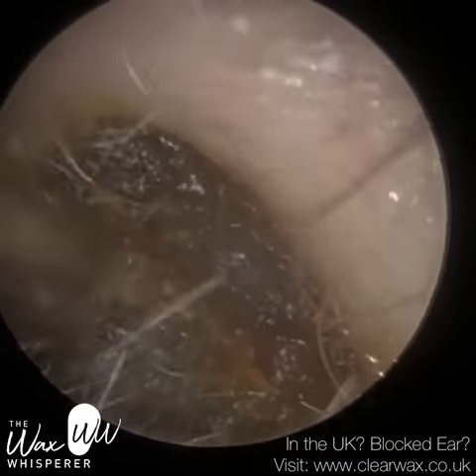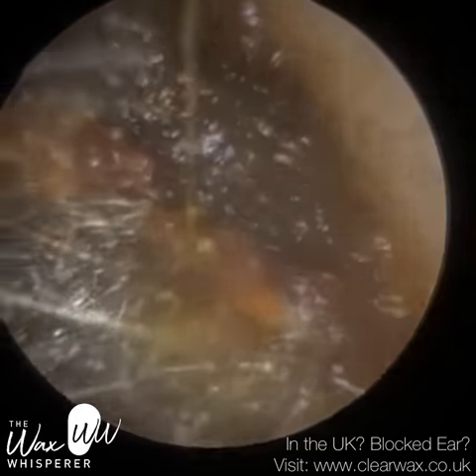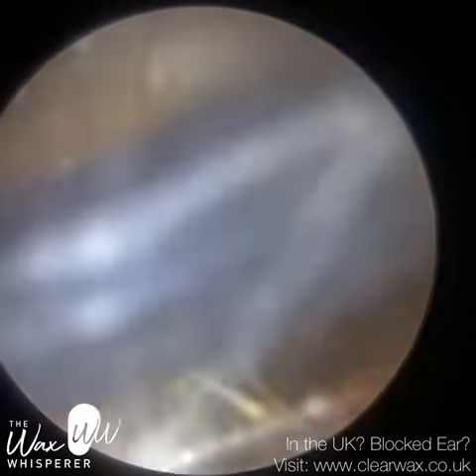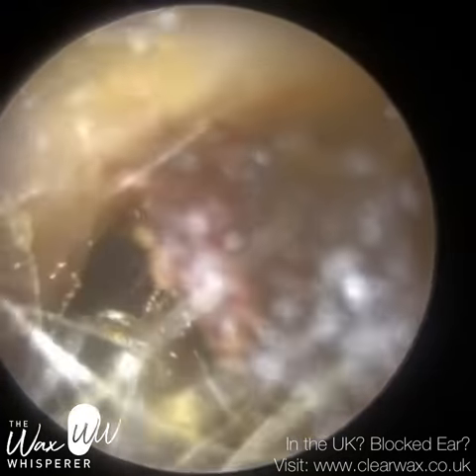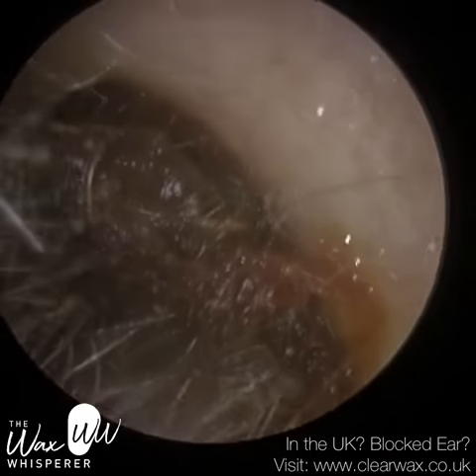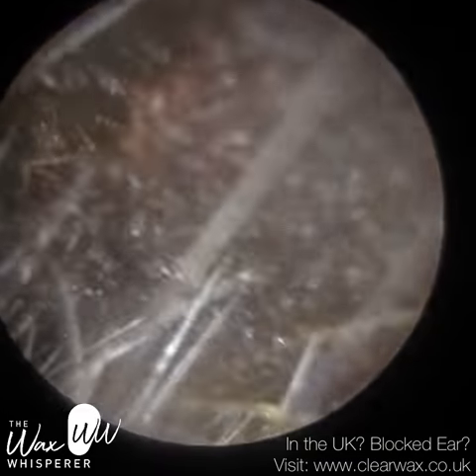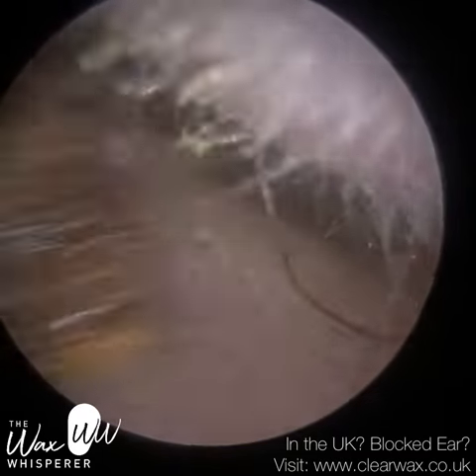Quite often patients are worried about that. What was causing the patient some discomfort was the fact that this plug was so large — and you'll see it at the end of the video — that as I was extracting it, it was rubbing and making contact against the canal wall. Although the outer part was a bit softer, the core of the wax plug and the tip deeper in the ear was quite rough — it was like sandpaper. So as you're bringing that out, it grazes the canal wall. In fact, the patient mentioned at the end of the procedure that the ear felt a bit itchy. I explained it's just because the wax plug was making contact with the canal wall, and that should just settle down.